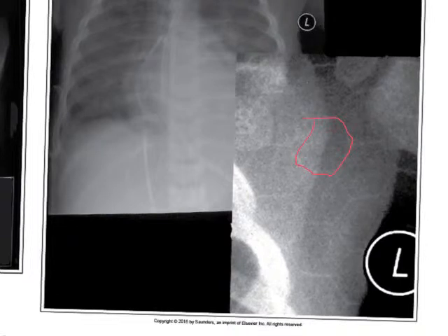Now, additionally, the other thing that would tip us off on this is we have some quantum mottle. So since the image plate was not exposed appropriately, it didn't receive the remnant beam appropriately, and so we have quantum mottle going on. It's very pixelated looking. So if I see this, the first thing I'm going to do is look at it real closely. Is this quantum mottle, or did I just have the thing backwards? Right?